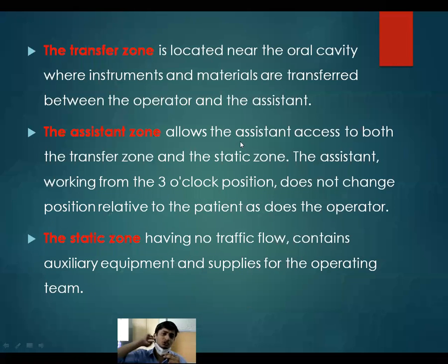Coming on to the transfer zone, it is located near the oral cavity where instruments and materials are transferred between the operator and the assistant. So from this zone only, the operator will give you material and instruments and take them from you. The assistant zone allows the assistant to access both the transfer zone and the static zone. The assistant working from the 3 o'clock position does not change position related to the patient as does the operator. So the assistant zone is very important.